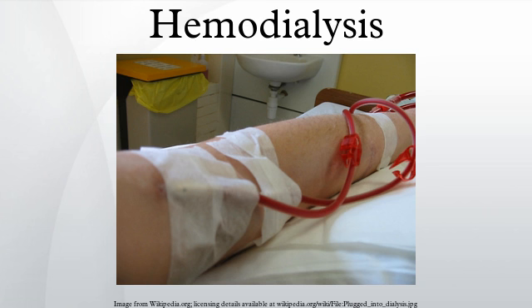The hemodialysis machine pumps the patient's blood and the dialysate through the dialyzer. The newest dialysis machines on the market are highly computerized and continuously monitor an array of safety-critical parameters, including blood and dialysate flow rates, dialysis solution conductivity, temperature, and pH, and analysis of the dialysate for evidence of blood leakage or presence of air. Any reading that is out of normal range triggers an audible alarm to alert the patient care technician who is monitoring the patient.